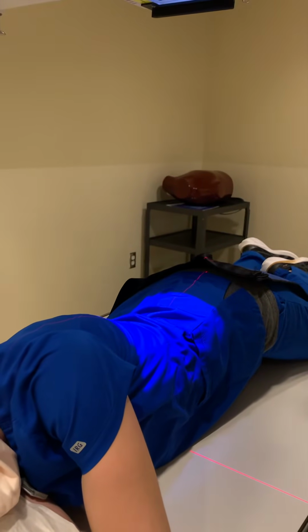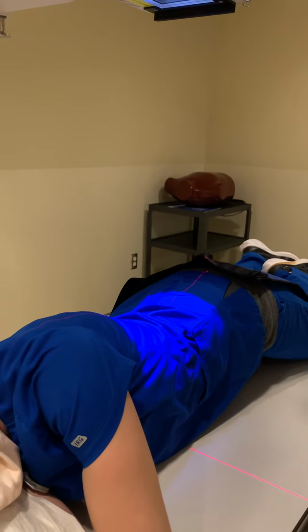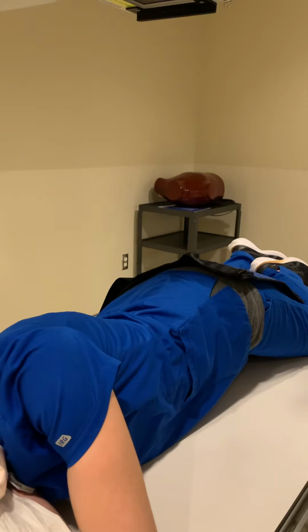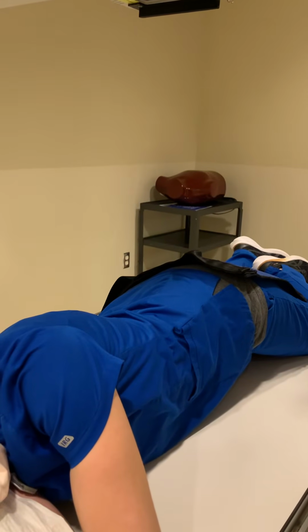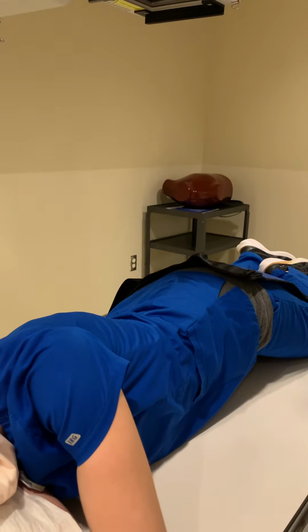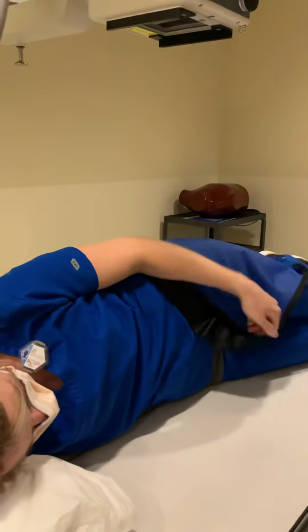In this view, we can see the anatomy of interest is the duodenal bulb, the loop, and stomach. There will be air in the fundus and barium in the body and pylorus. Okay, go ahead. Now we're going to move on to the right lateral stomach.